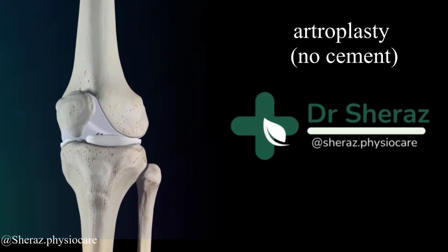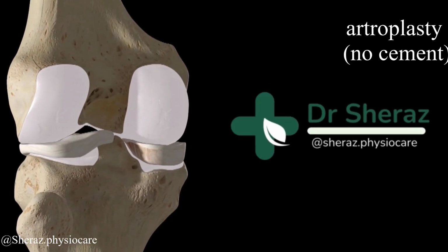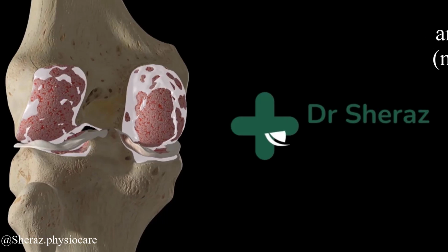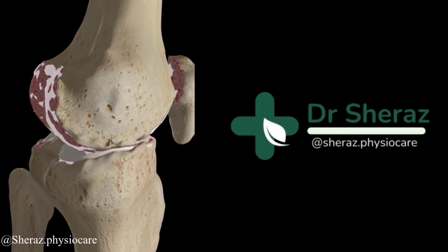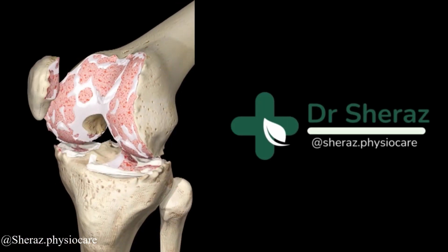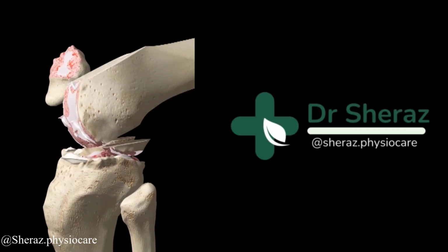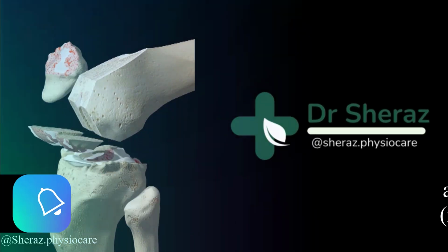Arthroplasty is a surgical procedure used to relieve pain and loss of joint mobility associated with osteoarthritis, rheumatoid arthritis, and other forms of arthritis. These conditions involve loss of joint cartilage and wearing of the bone, causing restricted mobility and pain. This procedure involves exposure of the anterior parts of the knee joint, displacement of the patella, and removal of the damaged or arthritic parts of the knee to shape the heads of the femur and tibia bones.